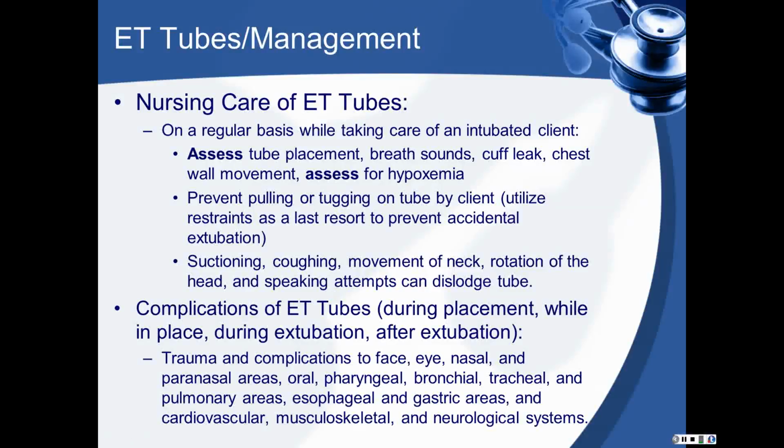Following up on the videos that you watched in part 2, nursing care of ET tubes, chart 34-10. Of course, your ET tube care is going to depend on whether it's inserted or intubated through the naso or oro, also if it is lodged in an incorrect placement or yanked out very forcefully, etc. If those are the cases, then your care may change a little bit.